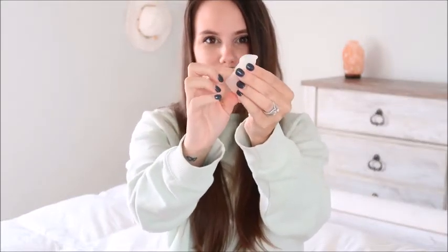There are apparently 7 different folds, but when you get the Diva cup, it comes with instructions and it only shows you 2 different folds. So I've only tried out these 2 folds. I haven't tried out any other ones, so I'm just going to tell you about the 2 I've used. The first fold is a U fold, and it just looks like a U. The other fold is a punch down fold. So you just punch it down in the middle. You take your finger and you punch it down, and then you pinch it, and then it looks like that. So those are the 2 different folds you can use.